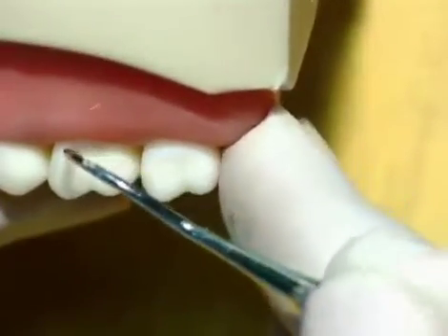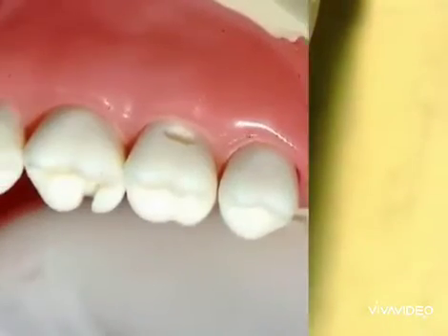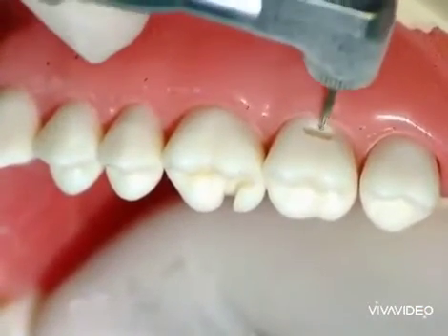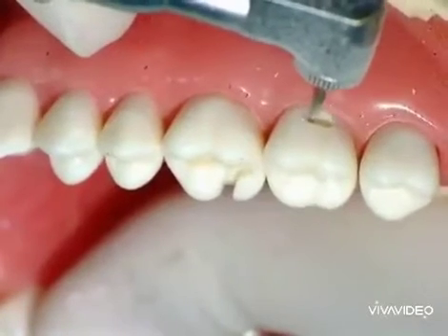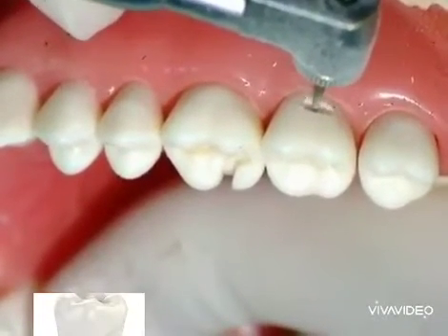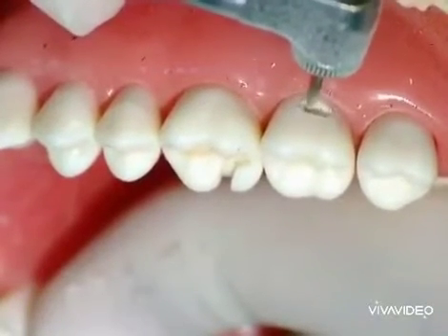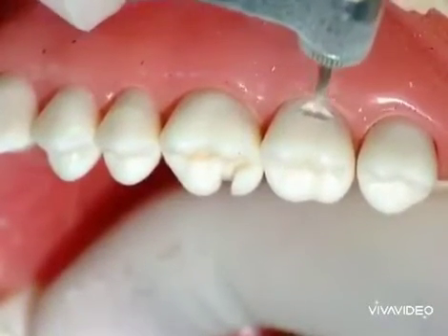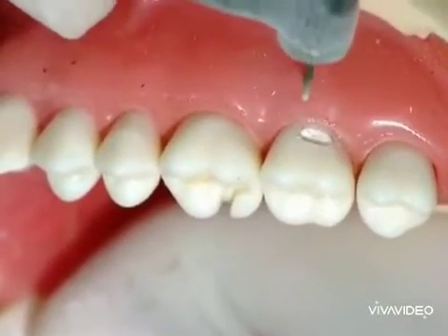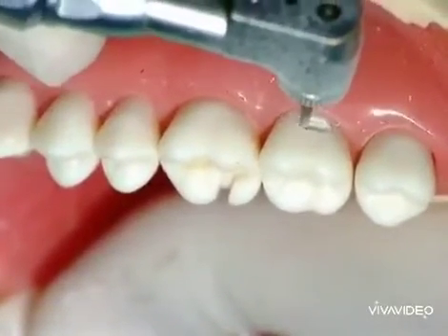Check the cavity smoothness with a probe — the mesial and distal walls. Here we can do the final finish with a fissure bur for the cavity.